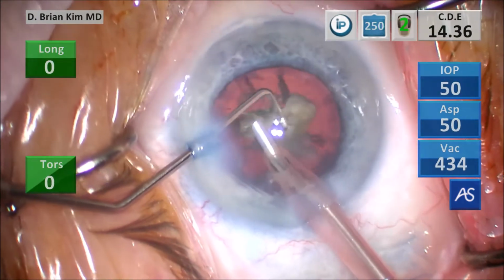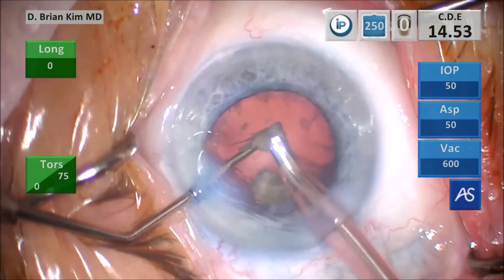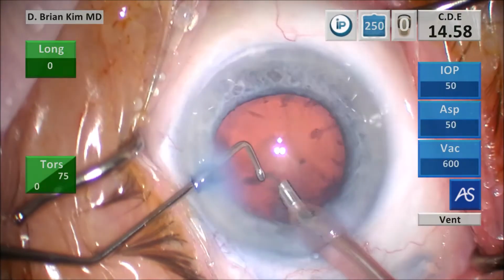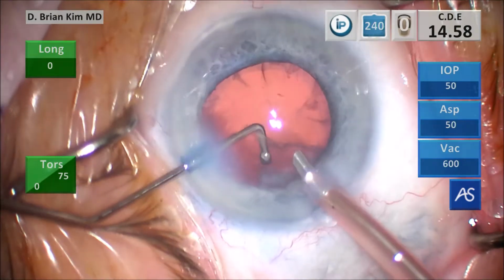Because I do this all the time, I've become really, really good at it. And so because you get good at it, the risk for complications is really low. You're very efficient with the lens disassembly. And again, the chances of wound burn and post-occlusion surge and posterior capsular rupture is really minimal.